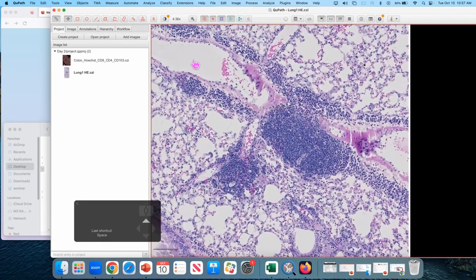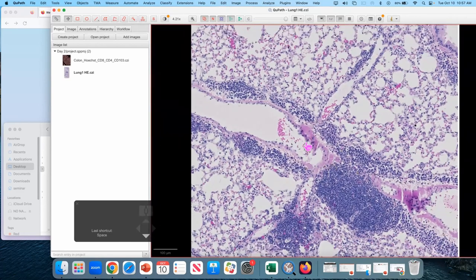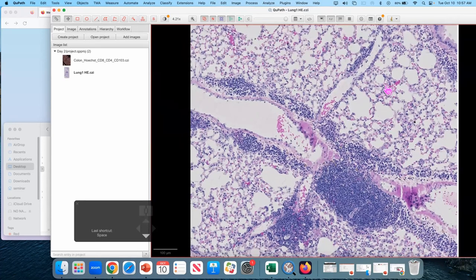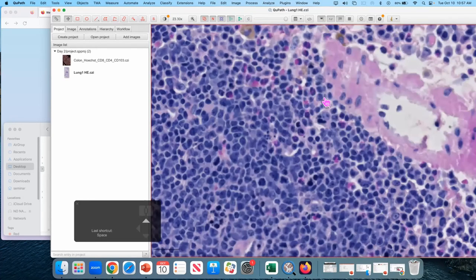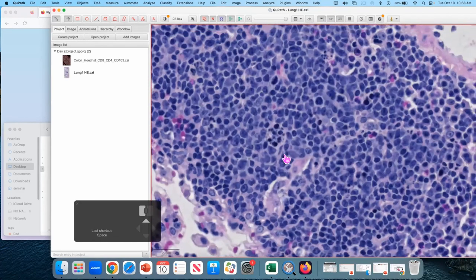It's sitting next to some blood vessels, and you could say that this is just around this vessel, but it could be a few microns over that you actually have the bronchiole, and often the vessels and the airways do run together. This is a very busy slide. A lot of pathology going on here.